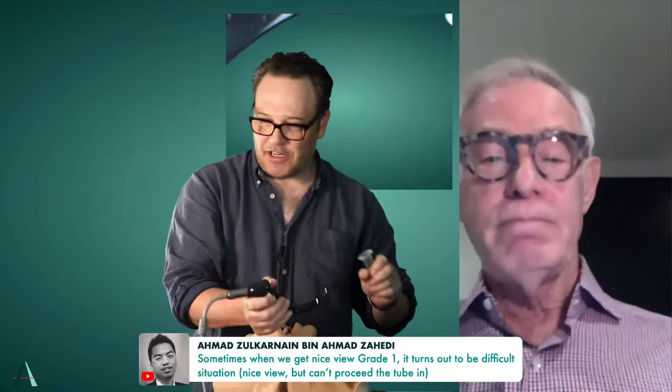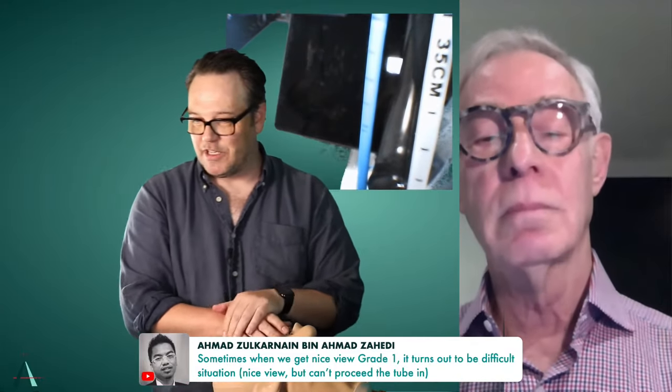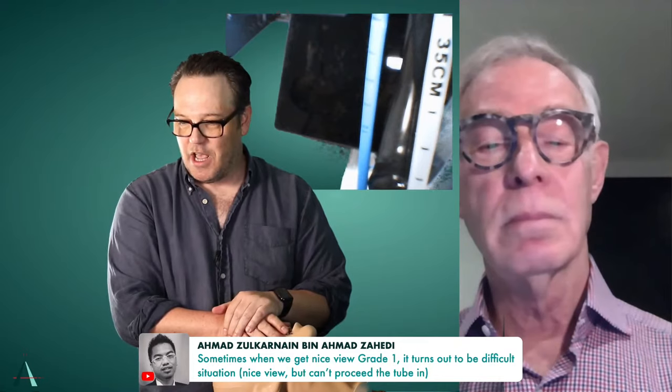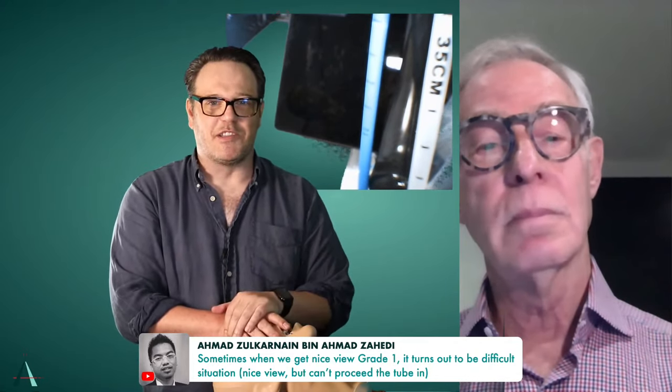Yeah. So I've got another question there from the audience. Sometimes when I get a nice view, a grade one view, it turns out to be a difficult situation. A nice view but can't proceed the tube in. I think we've just discussed what the reason for that is, isn't it? It's that pulling back changes the angle of approach. So Will is now telling Richard what he's saying.